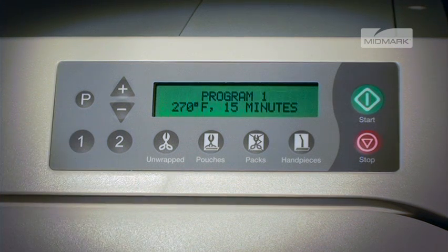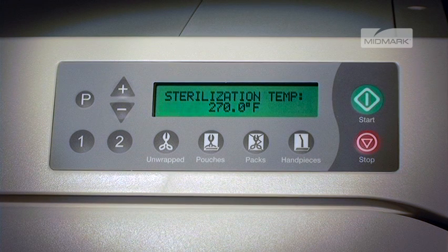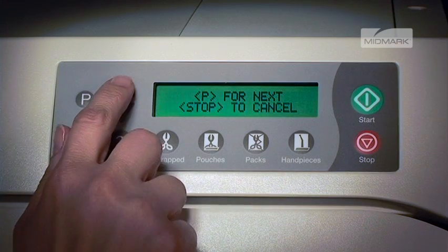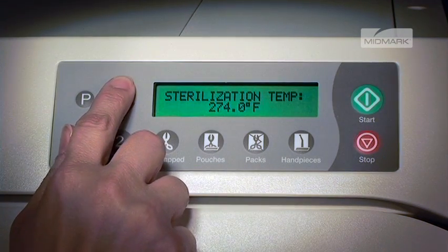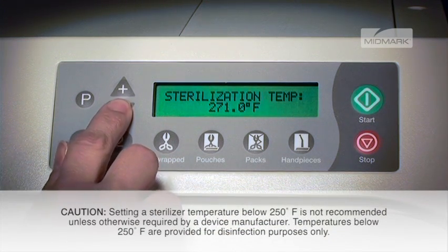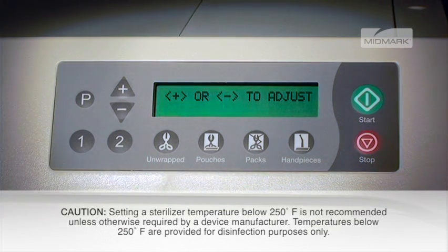The display will show the current stored program and all cycle parameters. To reprogram, start by selecting the P button, and the display will show sterilization temp and the current value. Then press the plus or minus button to adjust, followed by P for next, or stop to cancel. Any temperature from 230 degrees Fahrenheit up to 275 degrees Fahrenheit can be selected.